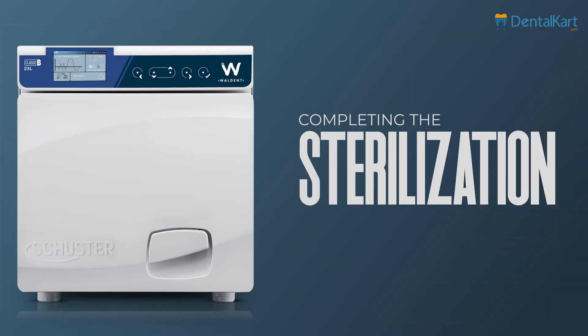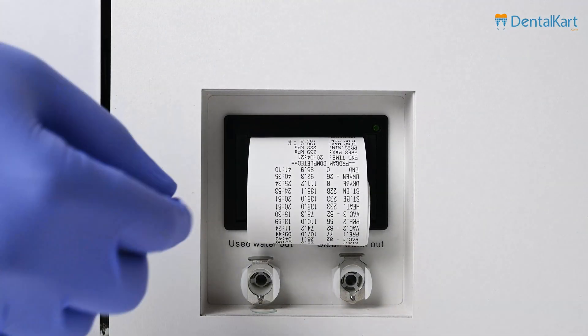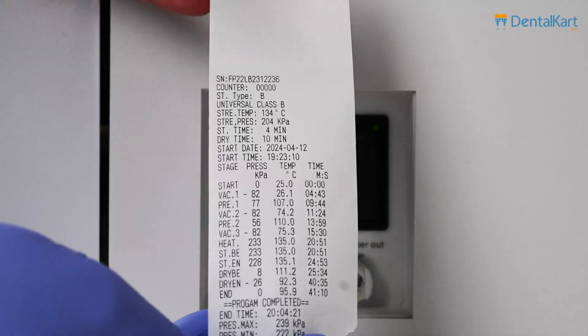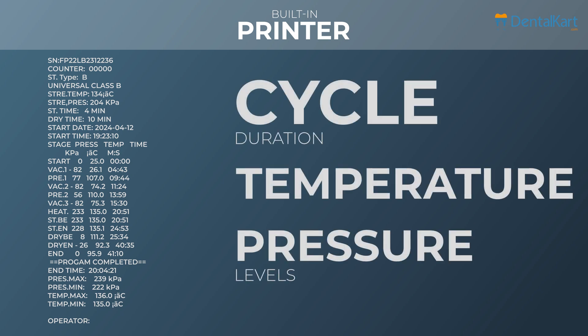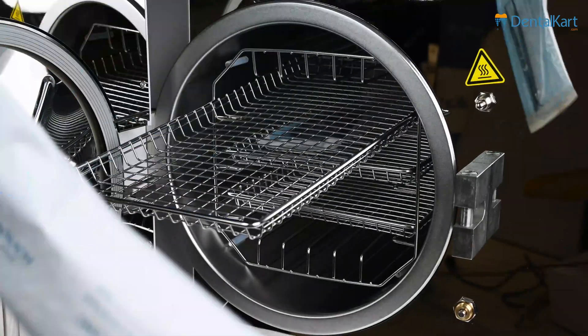After completing the sterilization cycle, it is important to verify the efficacy of the process. The Walden Schuster autoclave comes equipped with a built-in printer to provide a tangible record of the sterilization cycle, detailing essential information such as cycle duration, temperature and pressure levels. This data is also automatically saved onto a pen drive connected to the autoclave's USB port, ensuring convenient storage and accessibility for future reference.